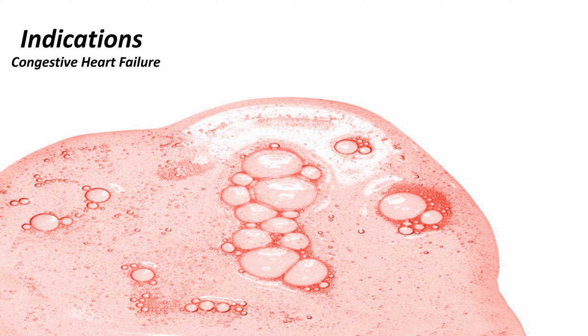So to explain it just a little bit differently, it is going to decrease the preload, which means the amount of blood that is coming back to the heart is going to be decreased, meaning that we'll have less fluid to back up into the lungs when the heart is unable to pump that blood.